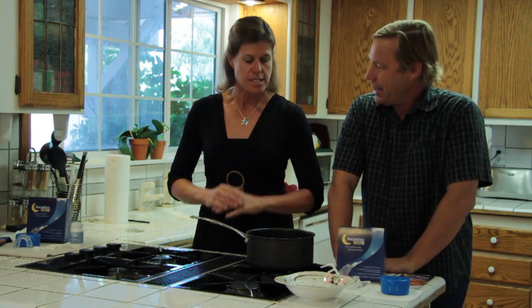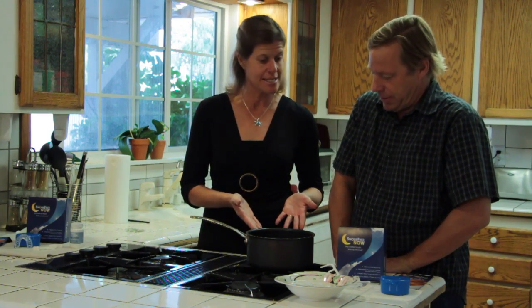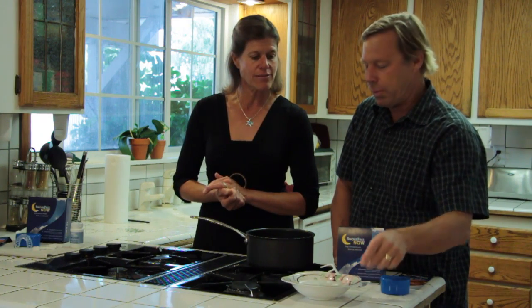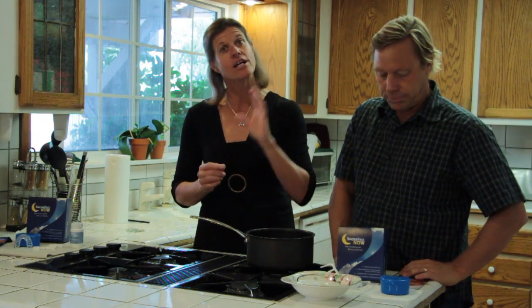And you too. So you have the correct amount of water in your pot, yes? Yep. You have your device, your mouthpiece, and you have ice water. Everything is handy, and you have a clock or a watch. It's right over there on the wall.